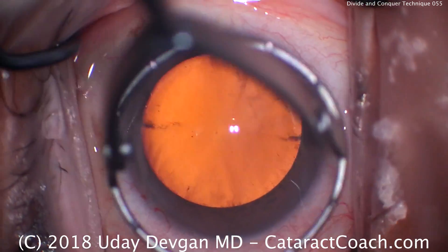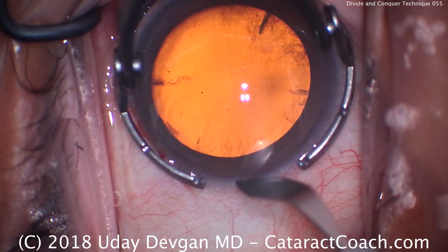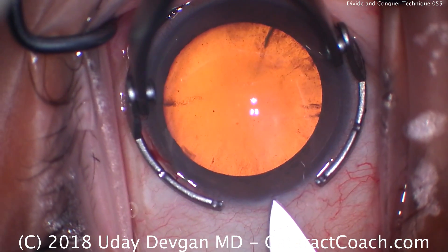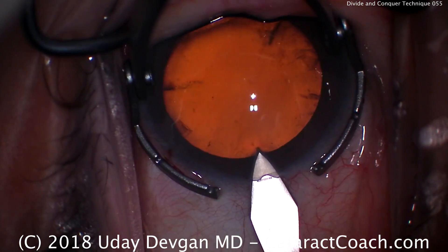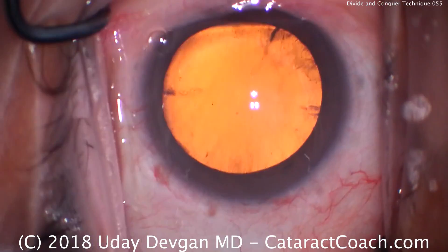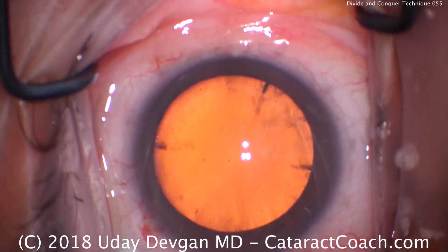We'll start off with the main incision here. I tell residents to make a slight groove right on the epithelium, advance the blade, and the tip should pierce Descemet's membrane when that line hits the epithelium right there. That's a very appropriate tunnel length — a nice square incision. Time for a capsulorrhexis now.